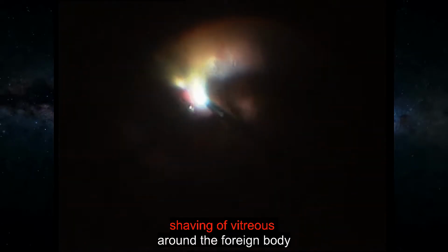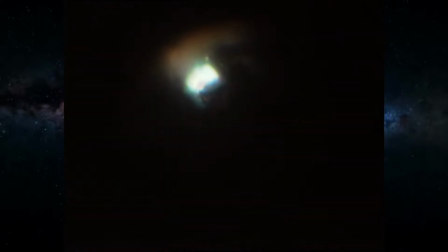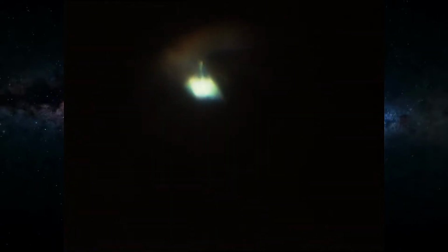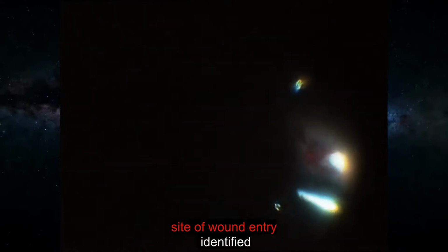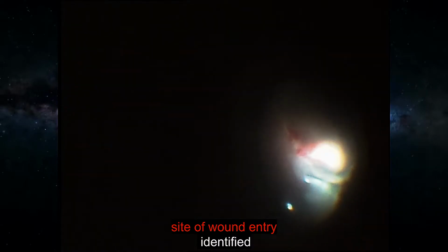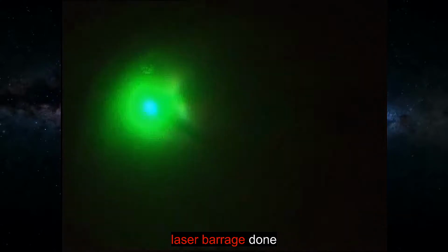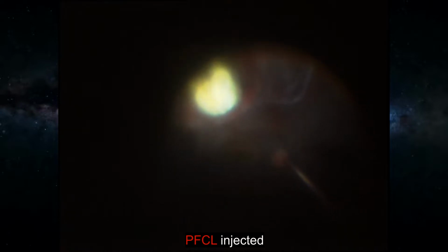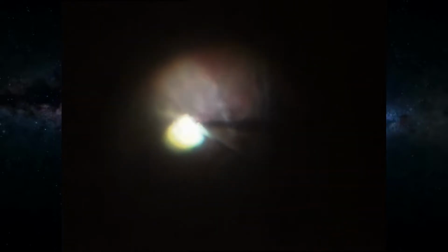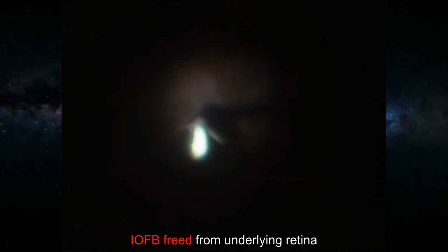Vitreous around the foreign body was meticulously shaved. The site of wound entry was identified in the supranasal quadrant while performing vitreous-based shaving. A laser barrage was done around the foreign body. Perfluorocarbon liquid was injected to prevent damage to the macula. The foreign body was freed from the underlying retina.